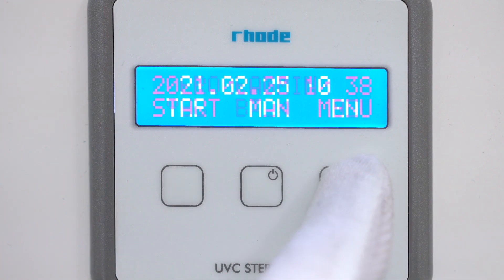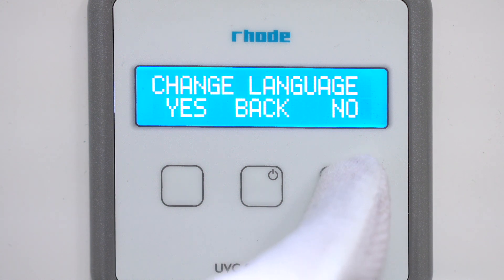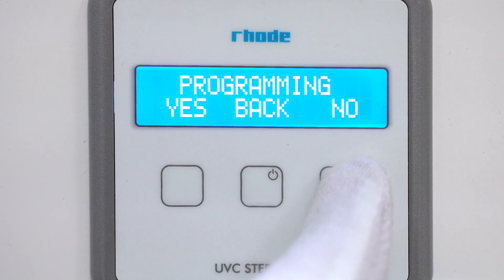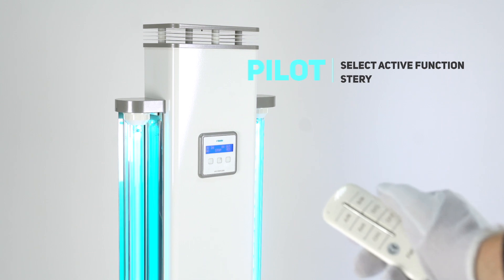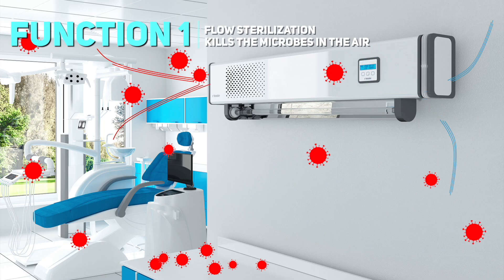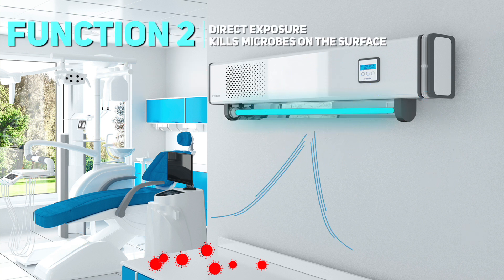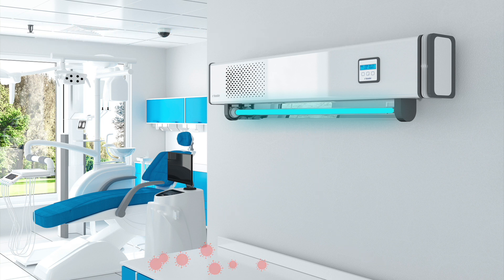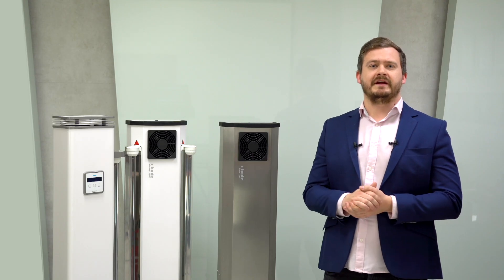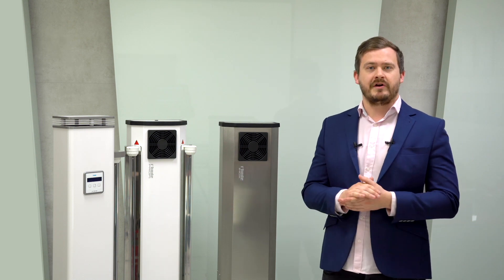In addition, the Elite programmer has many additional functions such as working time counters, alarms for replacement of radiators and filters, automatic and manual operating modes, and many others. Just like the Pro-Fi model, the Elite can be controlled by remote control or a mobile application. The interior of the sterilizer is protected against dust by a dedicated filter with increased active surface and low flow resistance, which can be replaced with an active carbon filter or a HEPA filter.